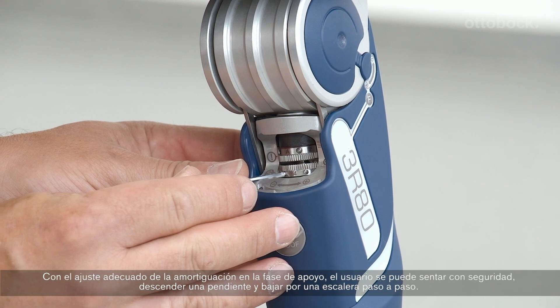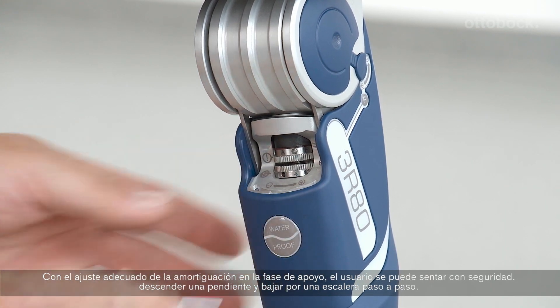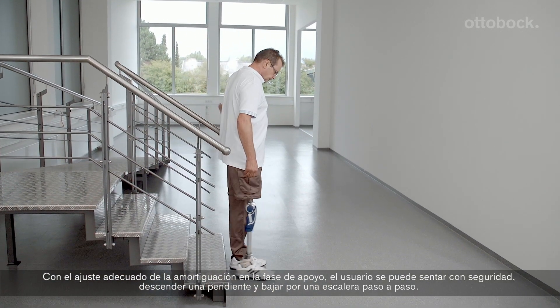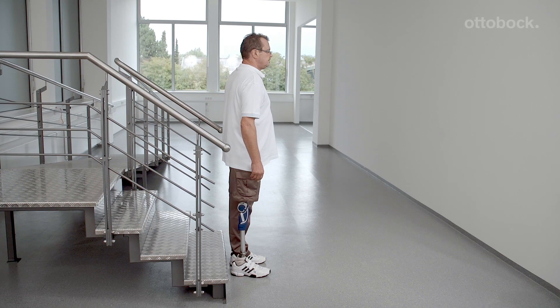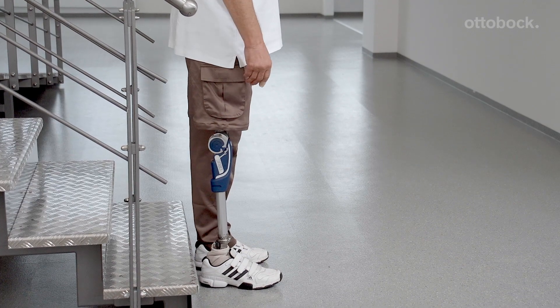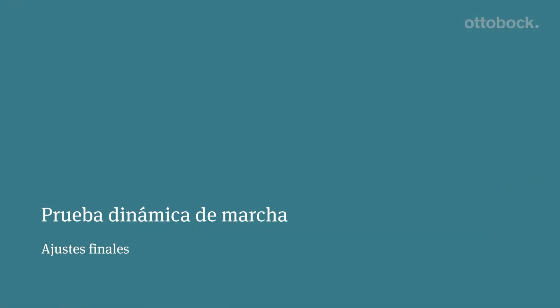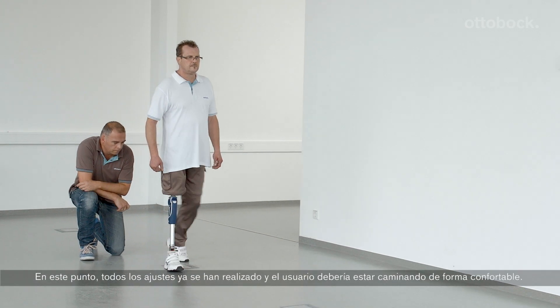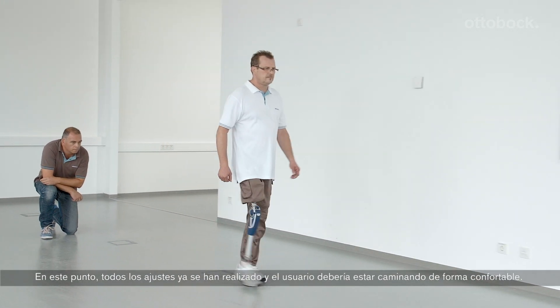With the proper stance phase damping setting, the user can safely sit down, confidently walk down a ramp, and descend stairs step over step. At this point, all adjustments have been made and the user should be walking comfortably.